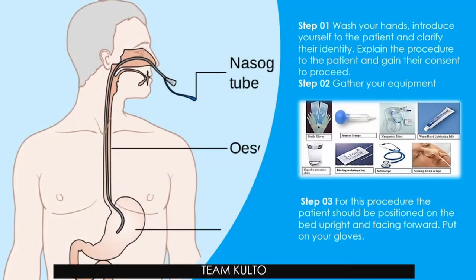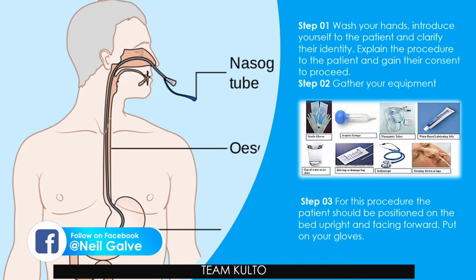Alright, so step by step natin to. Actually, I have 10 steps. Kinompress ko siya sa 10 steps only because I just really want you to narrow the concept. Maalala nyo sa cashier natin, napakahaba nito. Nursing fundamentals natin to. May mga rasyonale pa, pero gagawin natin siyang concise for now, okay?